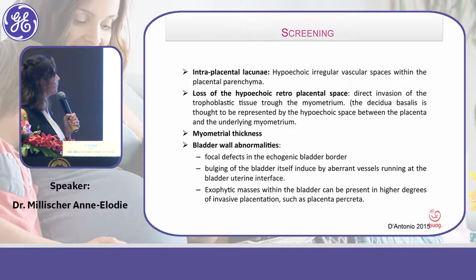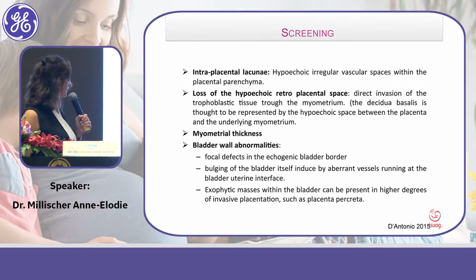Đây là cái hình ảnh của cái nhau, của phía sau nhau, mà khi các bạn phóng to lên thì các bạn thấy ở phía sau nó vẫn có cái đường echo kém, còn có những cái chỗ mà nhau nó băng qua cái đường echo kém mà nó đến gần phía trước bàng quang luôn. On this movie, you can see that there's a lot of lacunae, and you have a completely loss of the retroplacental space. Và trên cái hình ảnh này các bạn sẽ thấy được các lacunae và mất hoàn toàn luôn cái khoang phần echo kém phía sau nhau luôn. With placenta just near the serosa of the bladder.